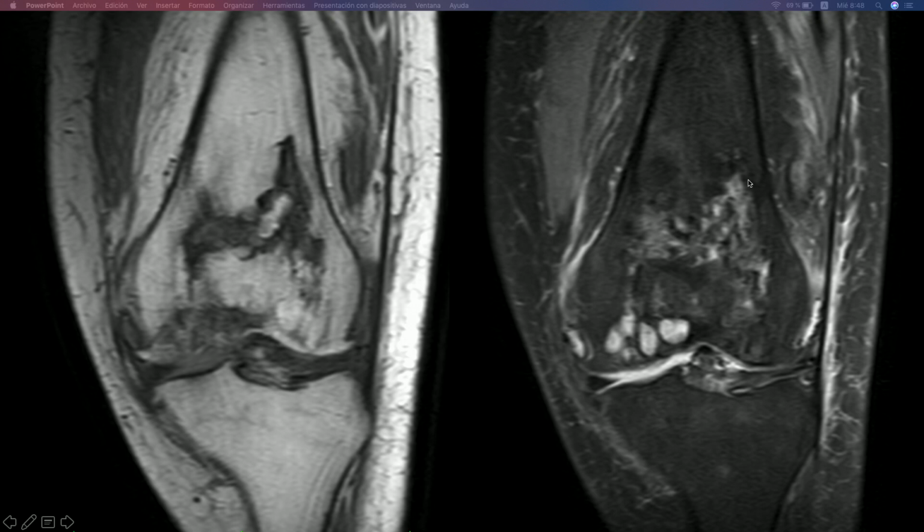We can see it as a low signal serpiginous pattern, which I'm not going to give that diagnosis yet, with internal low signal on the T1, and high heterogeneous signal on the proton density, which is a fluid-sensitive sequence. We can also see the double line sign on the proton density sequence, which is characterized by an outer low signal rim and an inner margin of high signal, which is the serpiginous demarcation between the living bone and the necrotic bone.